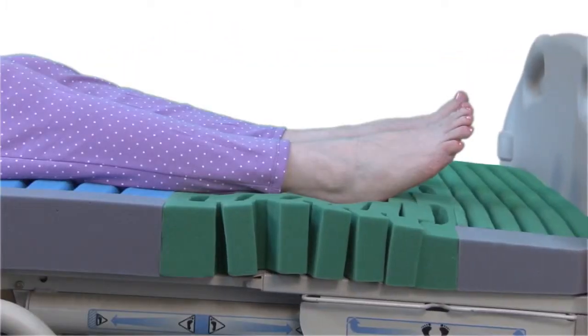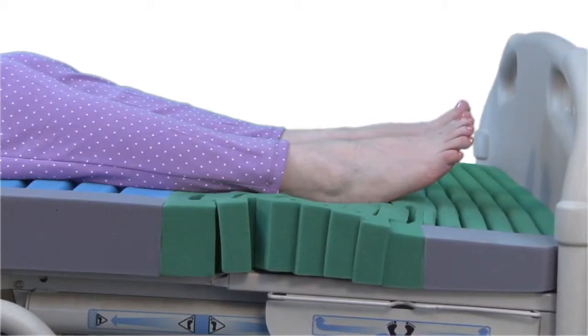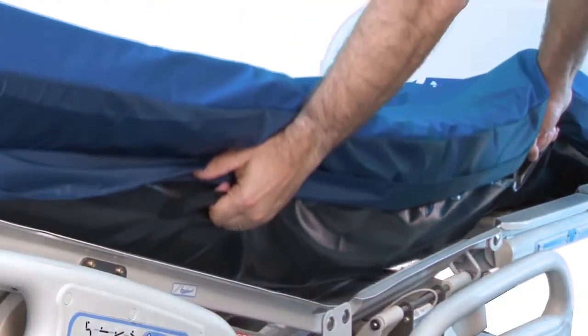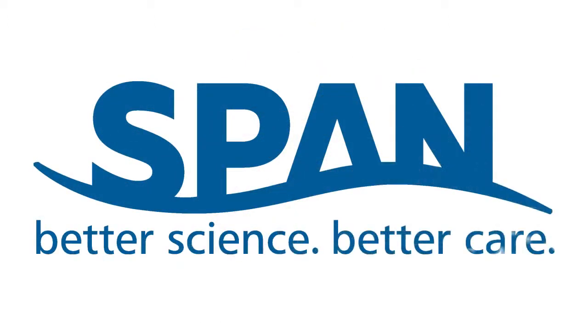A compressible section allows comfortable accommodation of multiple lengths and foot positions. Durable fabric handles simplify mattress placement. The Recess Deck Custom Care Convertible LAL from SPAN America — where better science means better care.